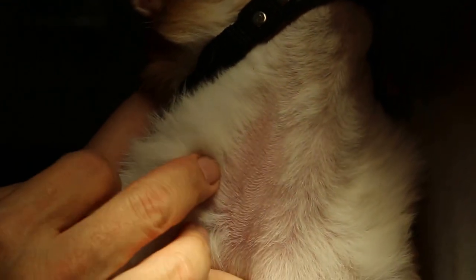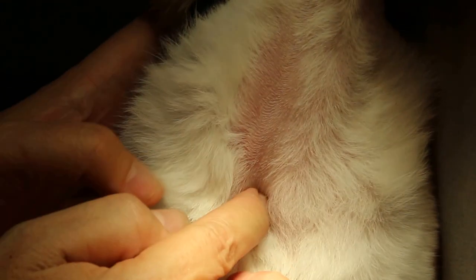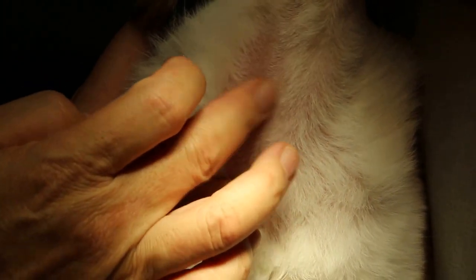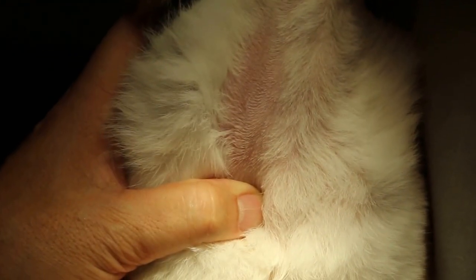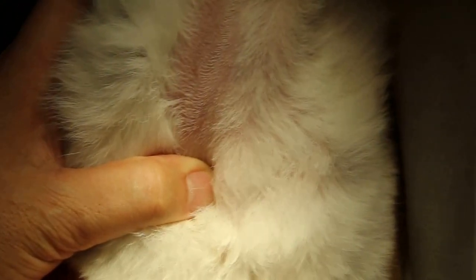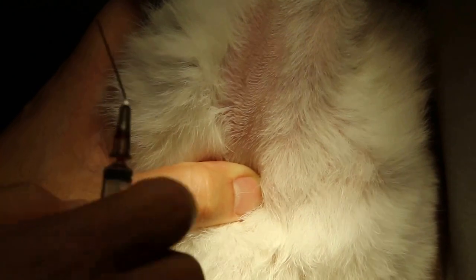Just hold it up. Extend the neck and press down here. Definitely a good groove. The needle should be bent a bit, and it should be 22g, maybe one inch.